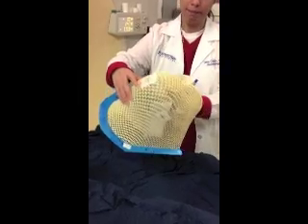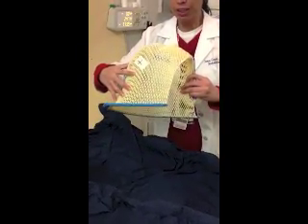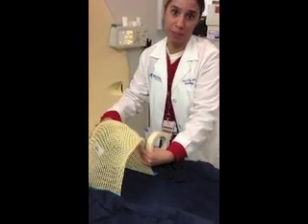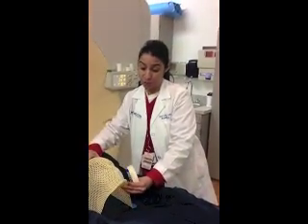One at the top of the head. Point laterally both right and left. And then at times one on the chin, just to make sure the patient's head is very straight.